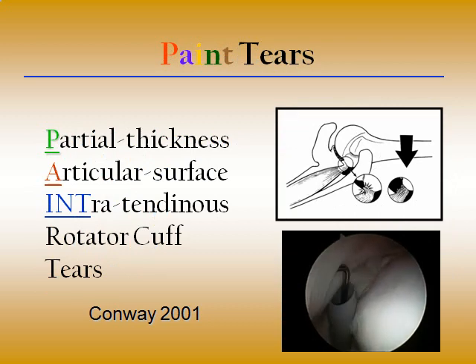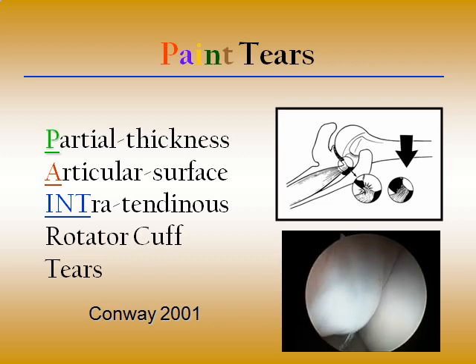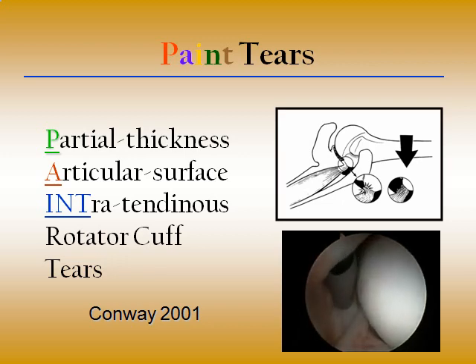PAINT lesion was coined by Conway. These are partial thickness articular-sided intratendinous tears, shown here by palpation between the articular layer, seen directly in front of us, and the bursal layer, not seen.